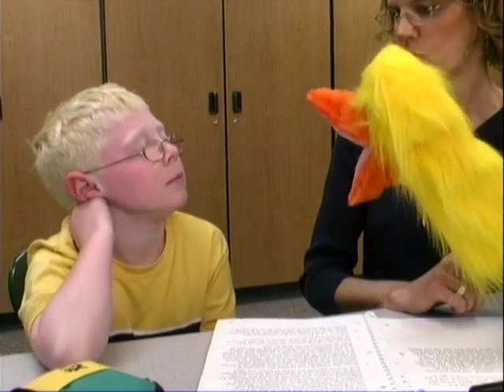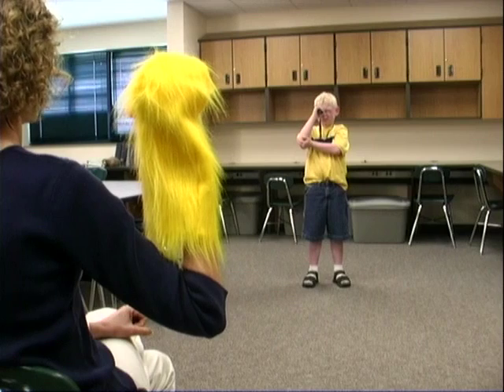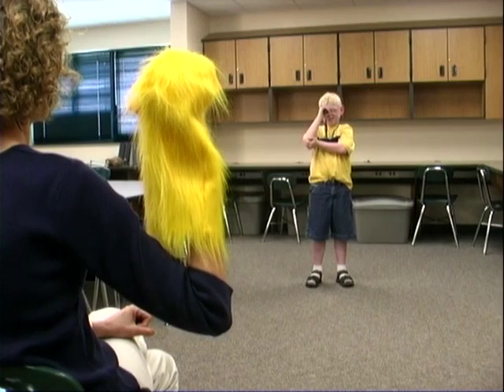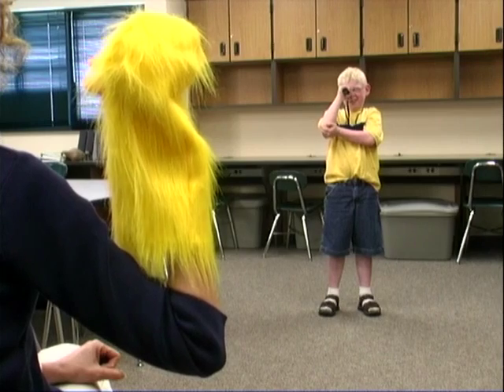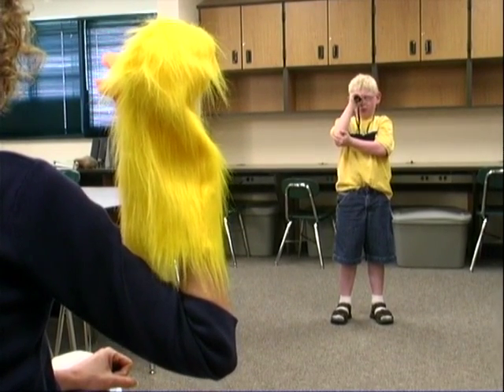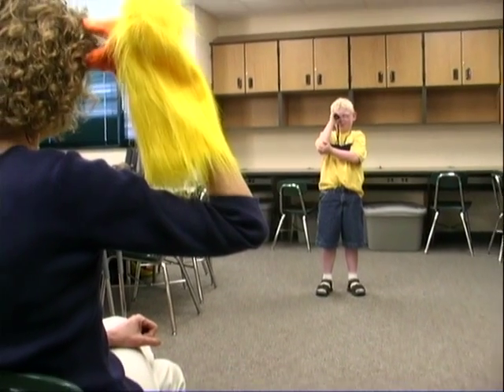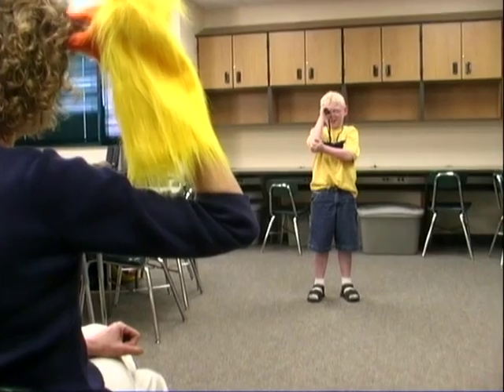Isn't Brandon a cutie? Brandon sure was embarrassed by that kiss from Emmy. Once you have your student's attention, you can start teaching him skills. Here's Brandon learning how to locate. While you're looking through the binocular, tell me what Emmy is doing. Opening and closing her mouth. I'm going to move her just a little bit — what's she doing now? It looks like she's eating your hair.